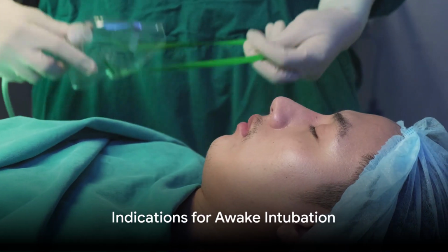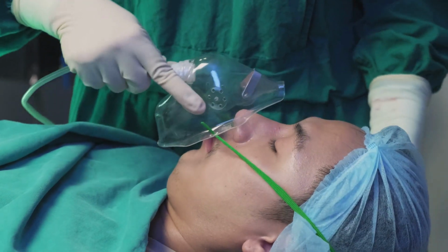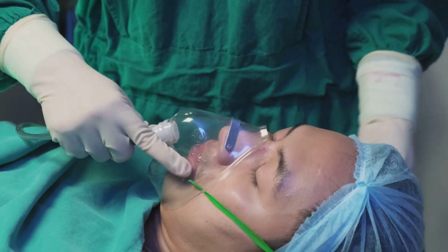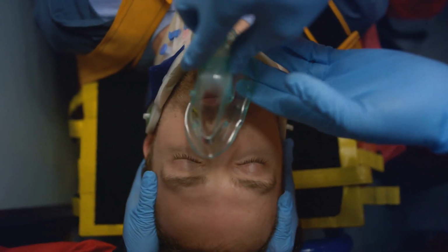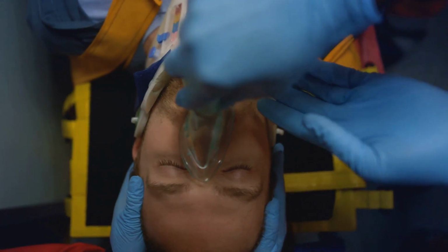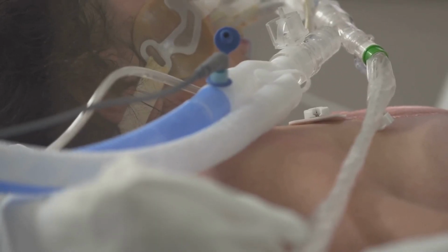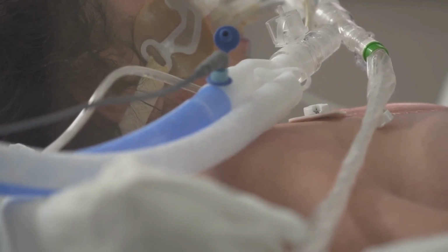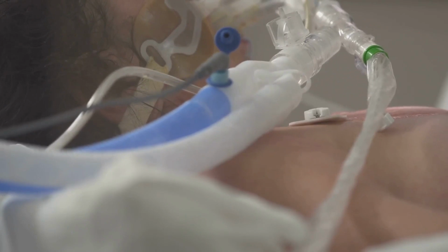When do we actually need awake intubation? This is a crucial question, as understanding the indications of this procedure is paramount. Awake intubation is typically indicated when traditional intubation methods are not feasible or safe. For instance, in cases where a patient has a known difficult airway, such as those with a history of previous difficult intubation, anatomical abnormalities, or extensive neck or facial trauma.